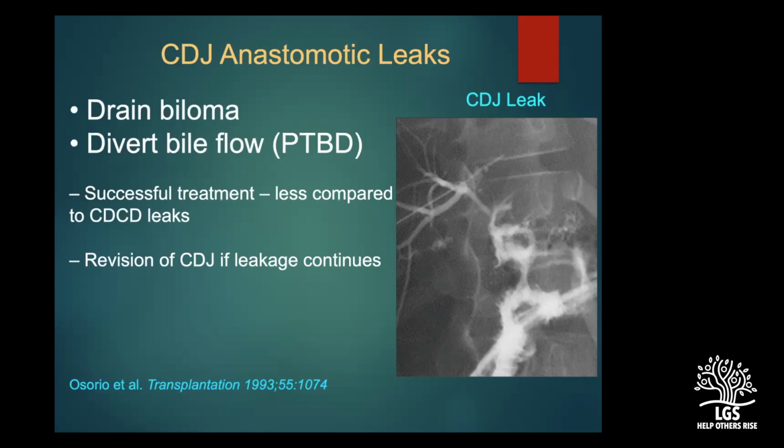And what we can resort in such cases is puncture the jejunal loop. I don't have the images right now, but we did a case wherein we punctured the jejunal loop. And from the jejunal loop, we can get inside the bile duct and we can put a stent, we can put a drain from the jejunal loop. And puncturing the jejunal loop is not an issue at all, because anyway, it's a sterile thing, so we can just get inside and we can do from a retrograde approach.